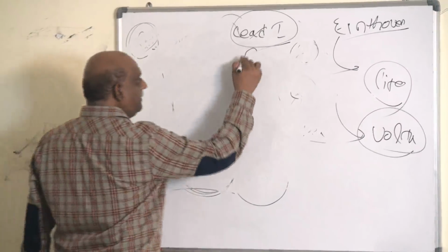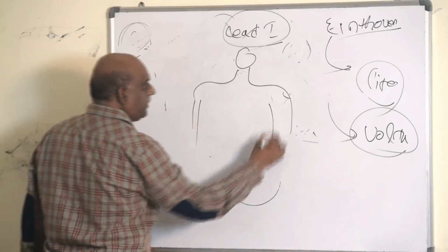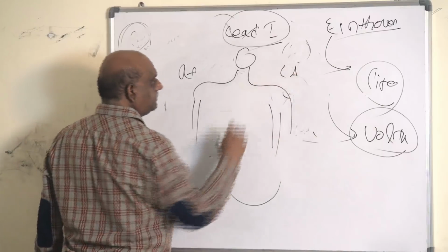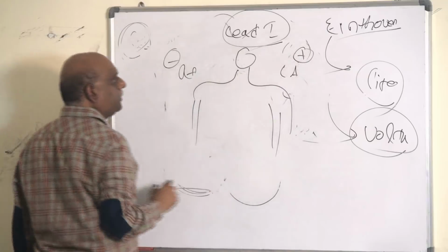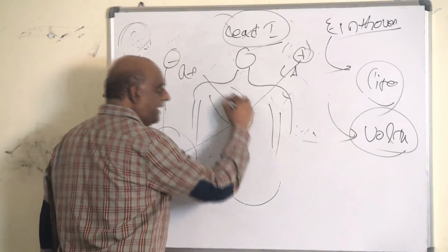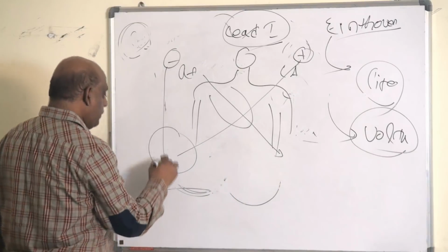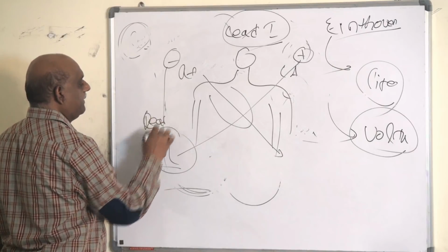How do you get lead 1? Typically, once more I am repeating for you, right arm, left arm. So negative electrode here, positive electrode to the left arm, connected to the voltmeter. Since the electrical activity is passing from the right towards left, you get a positive deflection in the lead 1.